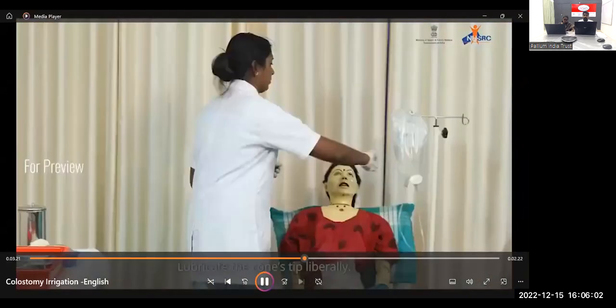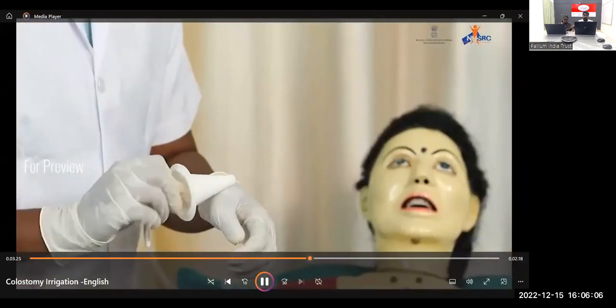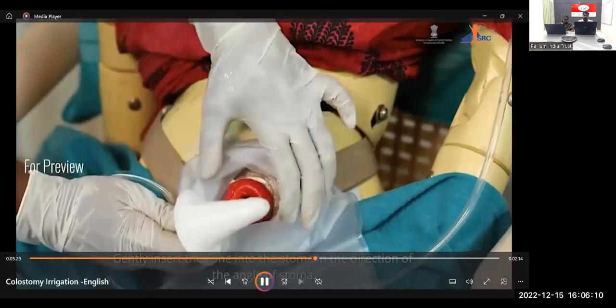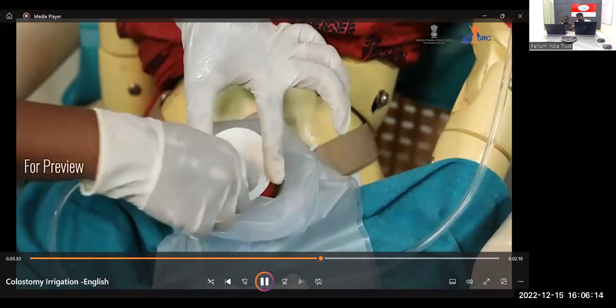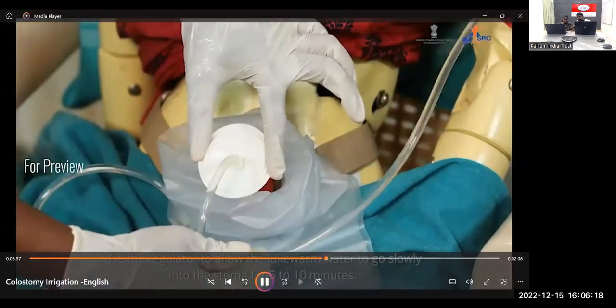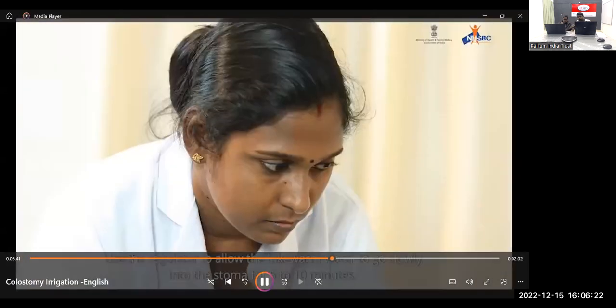Lubricate the cone's tip liberally. Gently insert the cone into the stoma in the direction of the angle of the stoma. Use the regulator to allow the lukewarm water to go slowly into the stoma for 5 to 10 minutes.